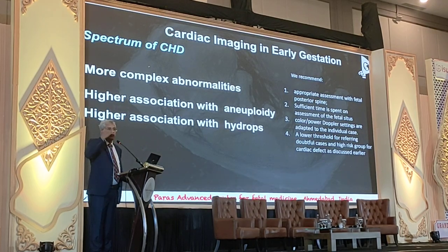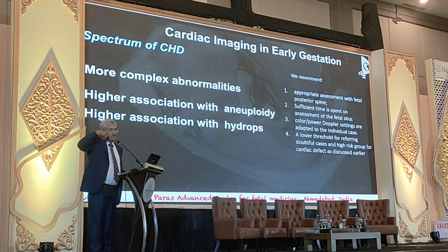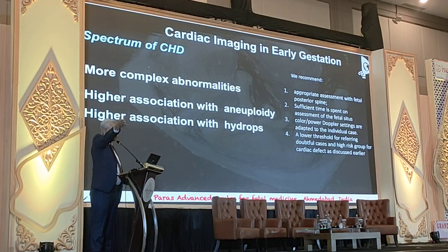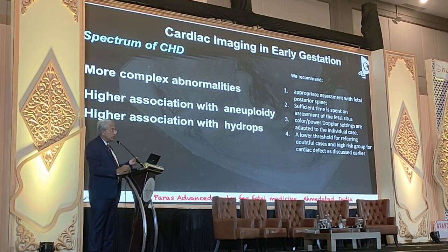Otherwise, what happens? Your mind is working. You start taking sections. In your mind, you try to collect all the sections and get a good complete picture. Here I am asking the machine to do it. I make the machine my slave. You do it for me. It's going to give you one complete picture. This is what the system is inside. So I ask my machine to do it for me. This is exactly what volume imaging is. There is nothing very special about it, but use it.